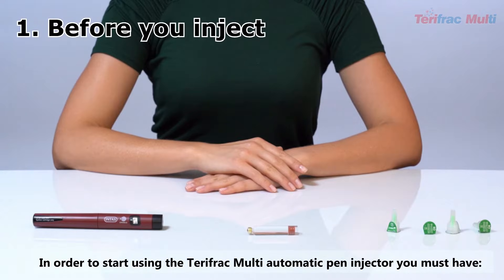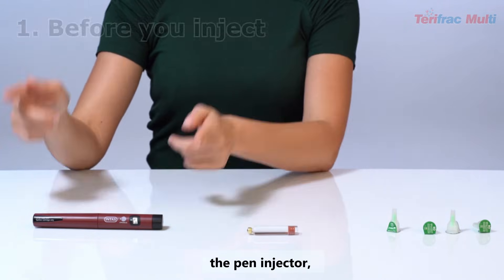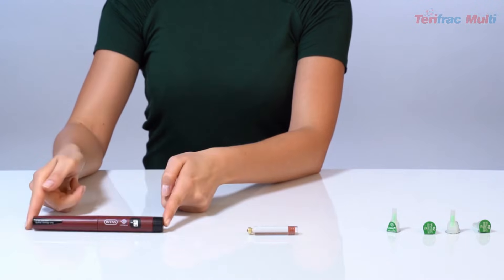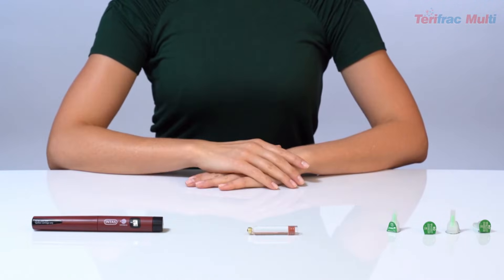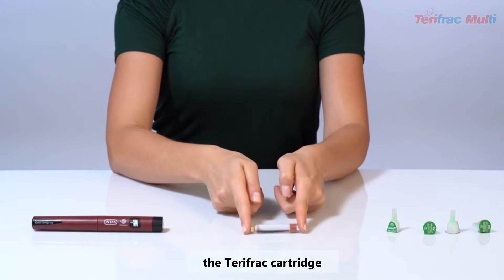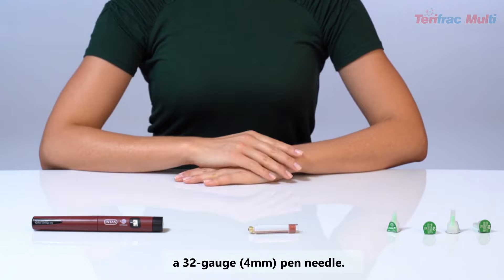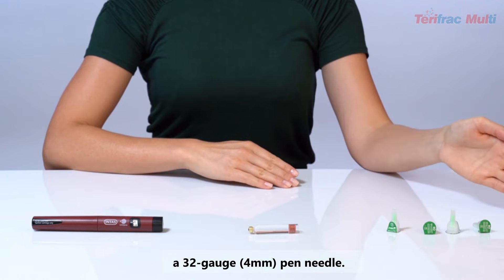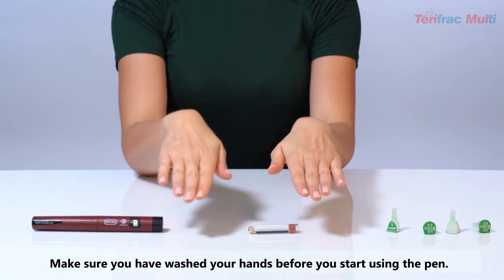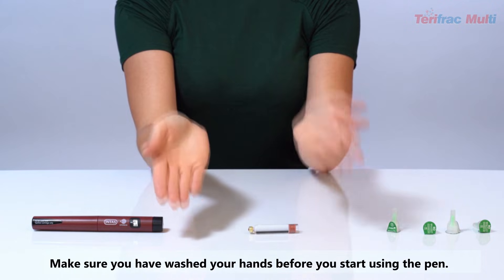Before you inject: In order to start using the TerriFrac Multi Automatic Pen Injector, you must have the pen injector, the TerriFrac cartridge, and a 32 gauge 4 mm pen needle. Make sure you have washed your hands before you start using the pen.